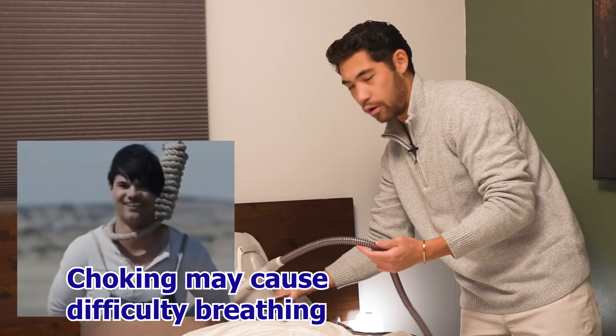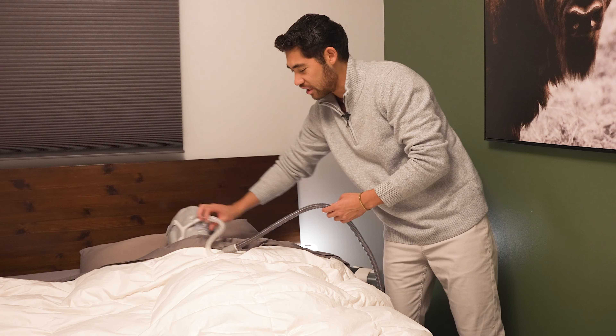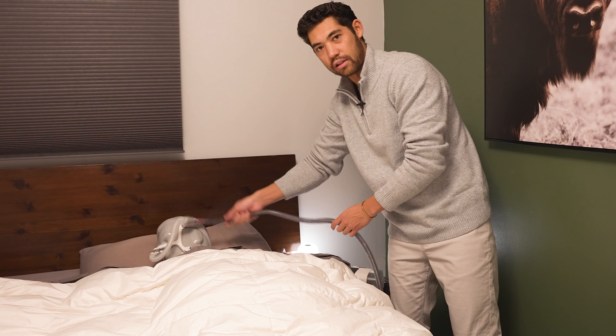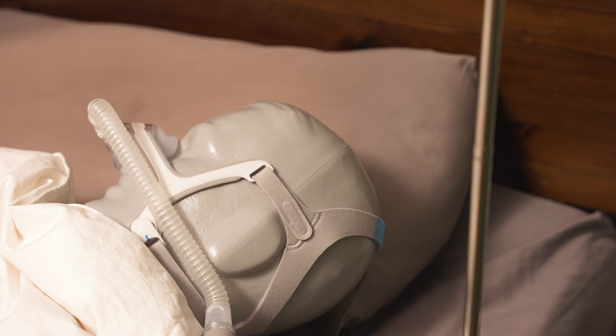We wanna be out of the choking position and have this tube nice and free. If he's facing this way, he doesn't really have an issue. But if he wants to face the other way, maybe face his partner, we're having some issues here with the tube. It's destroying his face and it's destroying his sleep.